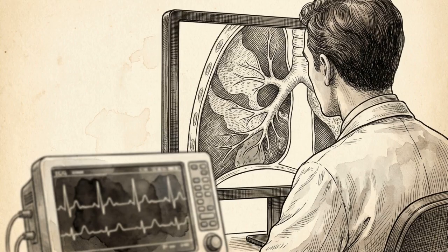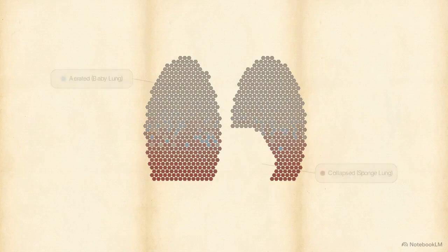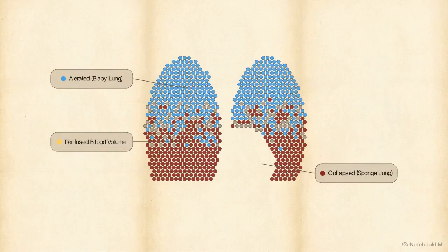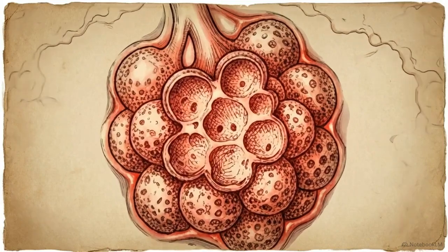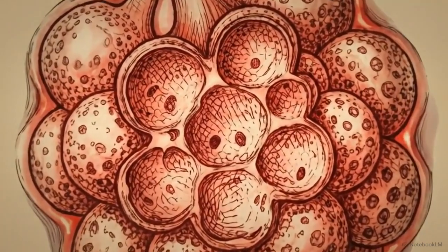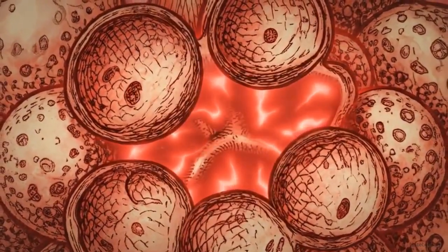Transitioning from standard bedside metrics to functional CT equips clinicians to treat the specific mechanical and vascular reality of an individual patient's lungs. Precision mechanical ventilation requires abandoning the concept of the lung as a single, uniform compartment. It must be treated as a highly complex, dynamic map of regional recruitability and perfusion. By characterizing these imaging-based subphenotypes, intensive care can move beyond broad strategies that historically failed and deliver targeted, life-saving support.